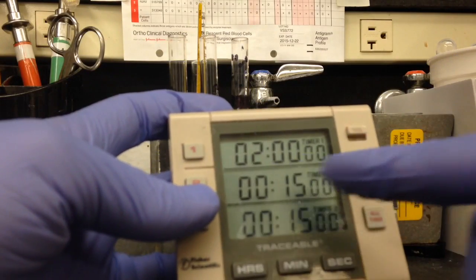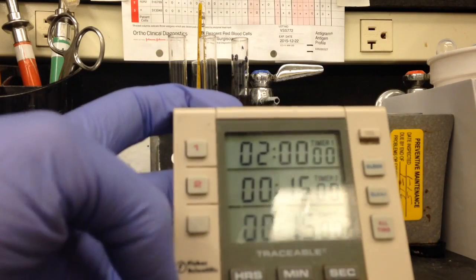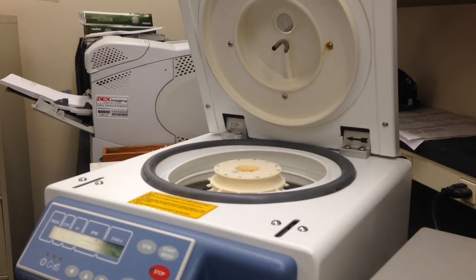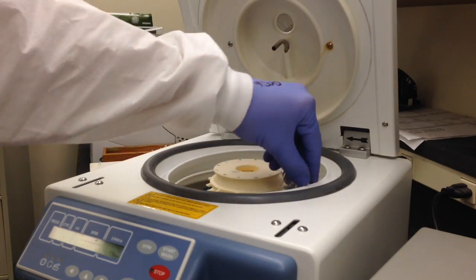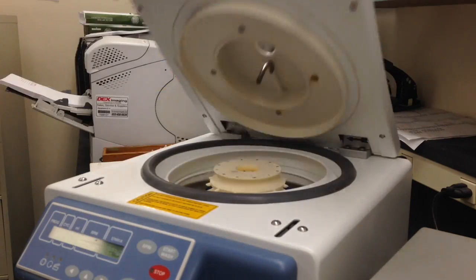You're gonna set a timer for 15 minutes and start it up. After this we're gonna go ahead and take those out of the incubator and we're gonna put them into our cell washer and we're gonna wash them four times.